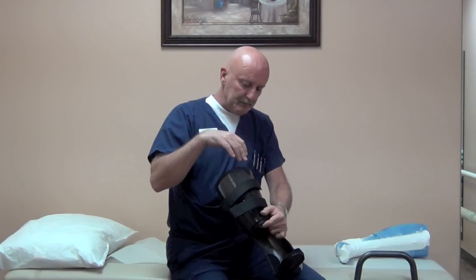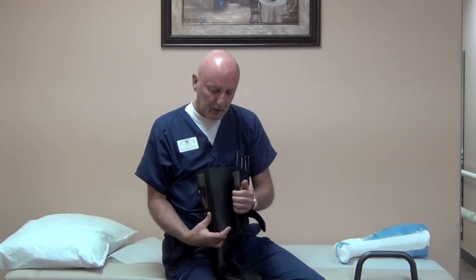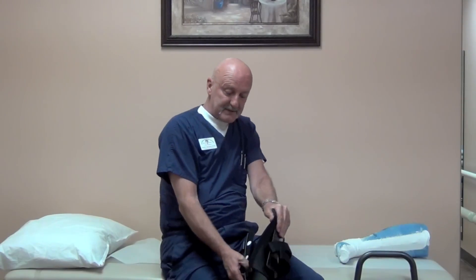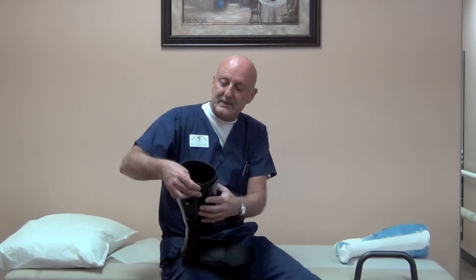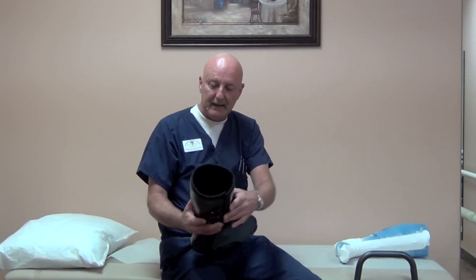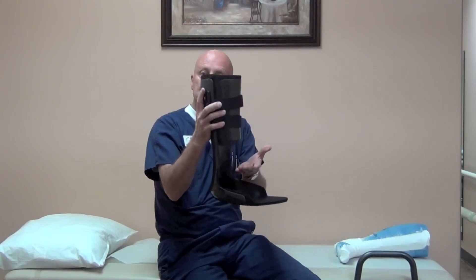We use a different type of layup up here so that it's a flexible anterior or front brim, so the patient can open this up, work their leg into the brace, and close it down. There's an overlapping EVA liner that provides circumferential control, and then this locks that down so we don't get any slippage in the fit. Just two simple Velcro straps tighten this up and support the weight through the calf area.